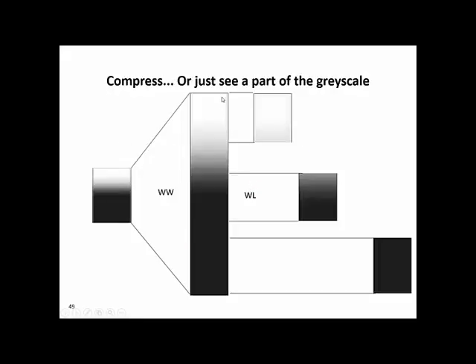In other words, a good DR detector would supply 64,000 gray levels from very white to very black. And if we would not have image processing, we could only view a part of it. With a normal window and level operation, without image processing, we could, for example, window into this area of the image. Then we would see the white area of the image in full resolution, gray level wise. But from here to black, everything would be completely black and we would not see anything.